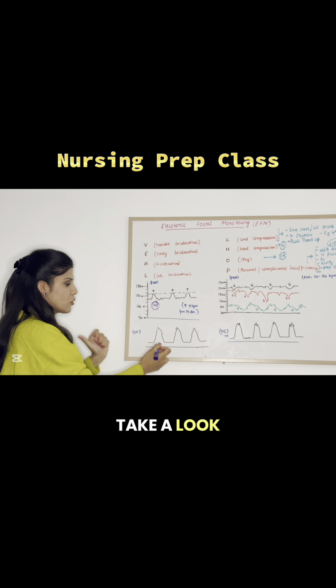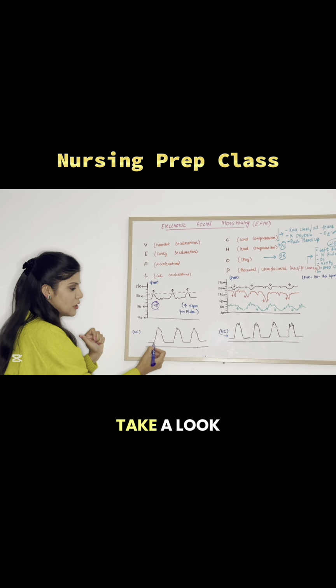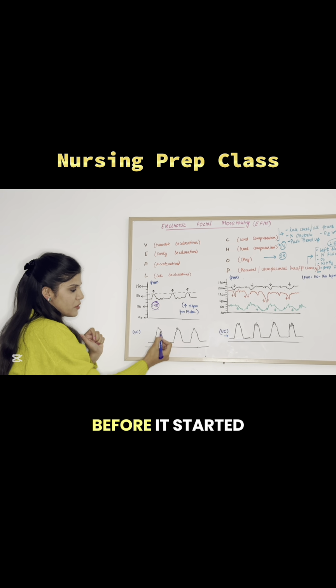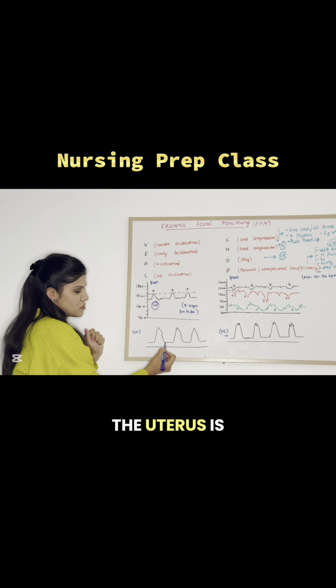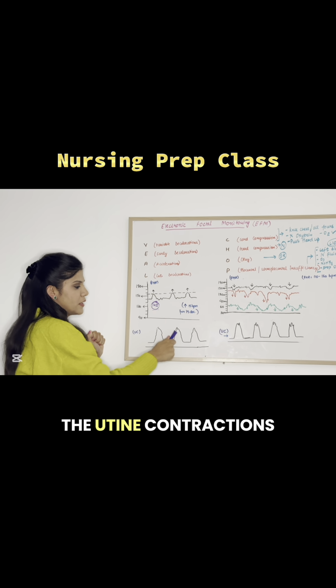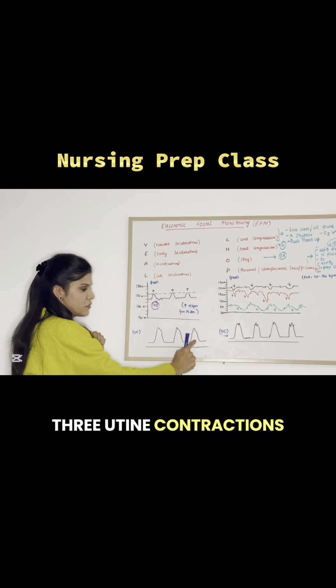So if you take a look right here at the uterine contractions, take a look how the uterine contraction has come. It has gone to the peak before it started coming down, and now here the uterus is relaxing, and then it again got onto its peak, and then again it got relaxed. So these are the uterine contractions. So we have three uterine contractions.